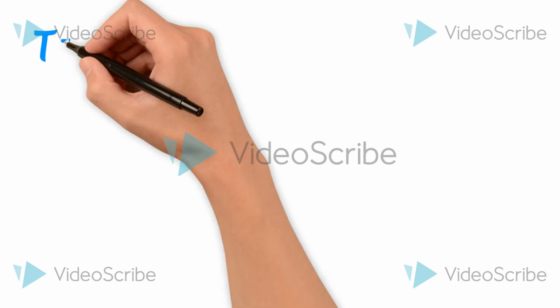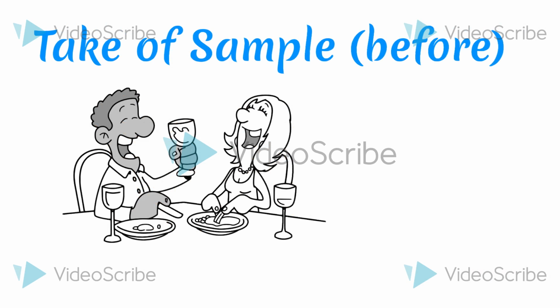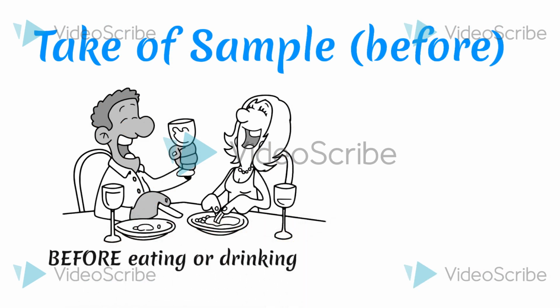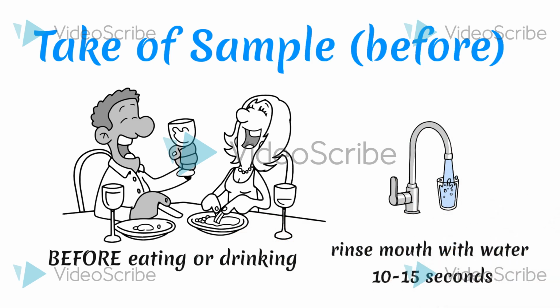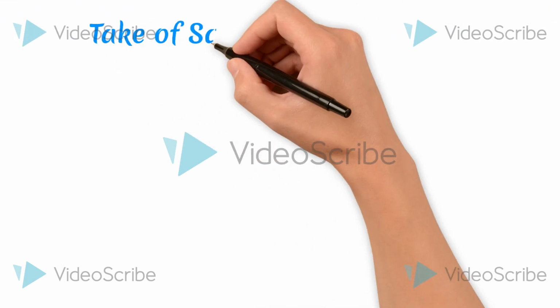It's very common that the sample to be used is sputum, commonly from a deep cough. A sample from early morning is collected before eating or drinking anything to avoid bias in interpreting the results. At first, the patient needs to rinse out the mouth with clear water for 10 to 15 seconds to eliminate any contaminants in the oral cavity.